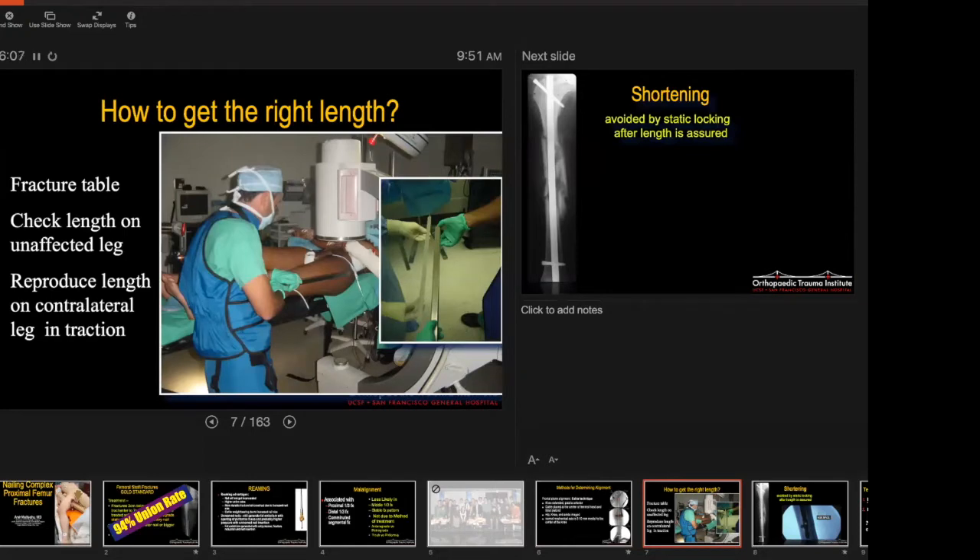To check length, with the patient on the fracture table, take a piece of metal and put it next to the leg. Take images proximally and distally of the non-affected leg first, then do the same on the contralateral broken side. Don't put the piece of metal on top of the thigh because you get parallax — C-arms are cone beams, which means parallax at the ends unless you have a flat panel. Put it next to the femur, measure the rod length, and recreate that on the contralateral side.